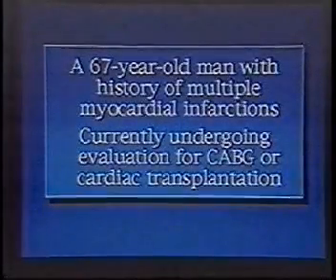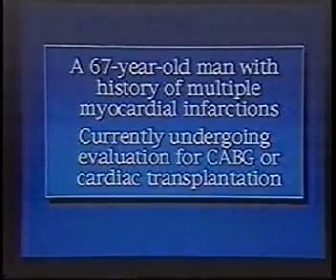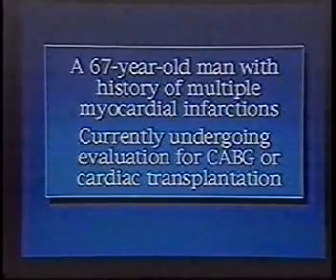Okay, next patient. Okay, so you know, you guys are actually lucky. I actually forced my residents to take these cases and discuss them, but I think I'm doing you a favor. Maybe not.